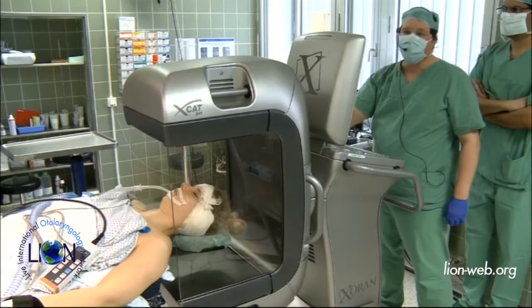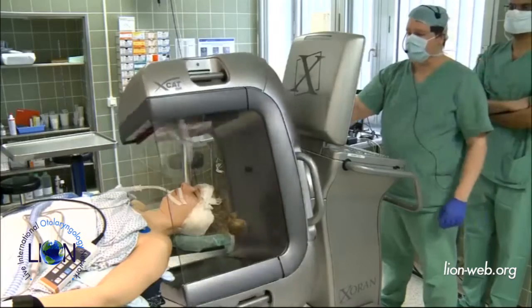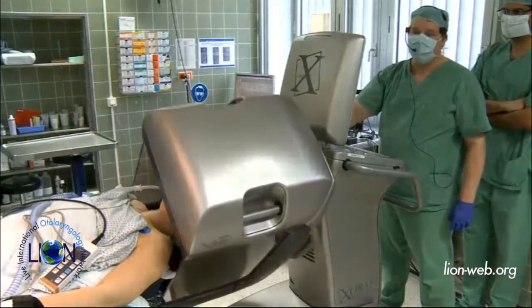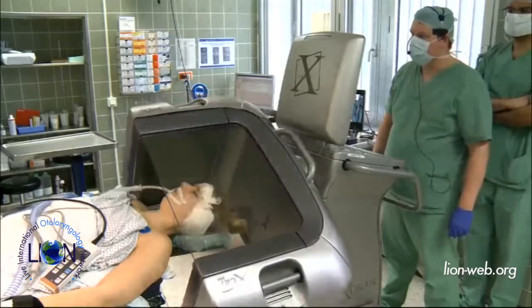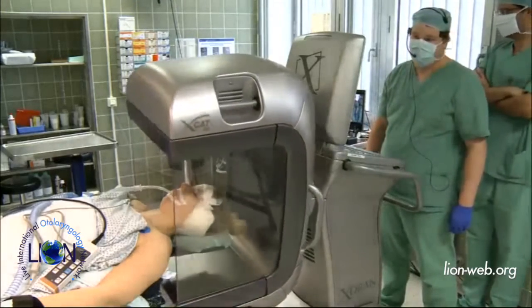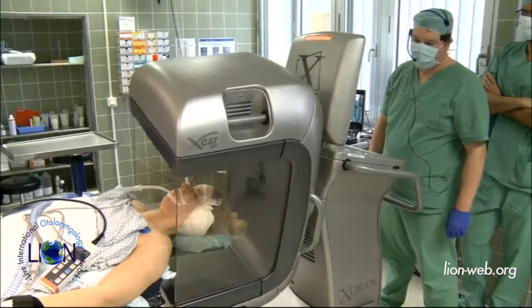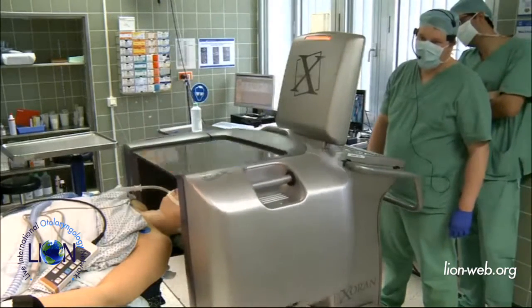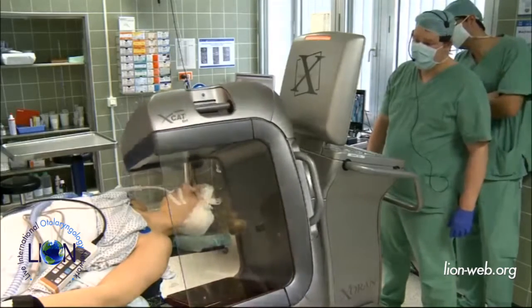It's coming into the right place. We turn it around a little bit. So it will start soon. How long does the image acquisition take? The whole process is 15 to 20 minutes, but the image acquisition itself is only 40 seconds. The acquisition is just 30 to 40 seconds, not more. Then you have post-processing.